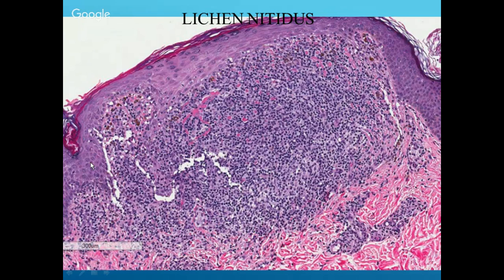These are common things that you see in practice, and as a resident, these are common things that you're going to see on your exams also, because these are things that you can recognize at a snap. They might either give you the histological image, or they may give you a slide to look at and make the diagnosis. These are diagnoses that you can make without any clinical history. So these are cases that you should know as a pathologist or as a dermatopathologist, because they are very common things that can come both in practice as well as in your exams.